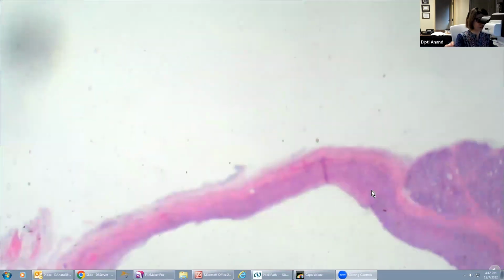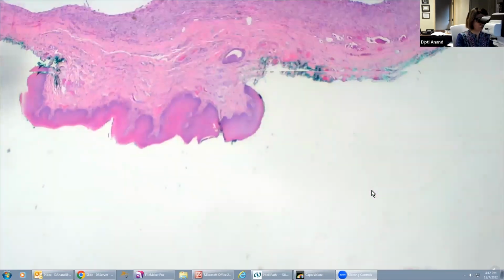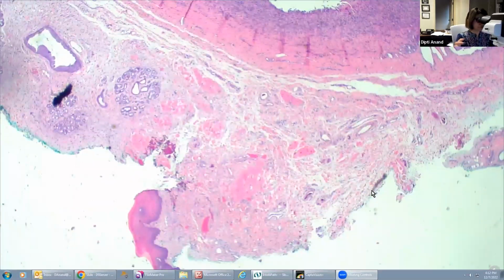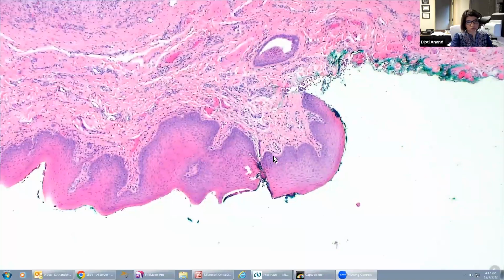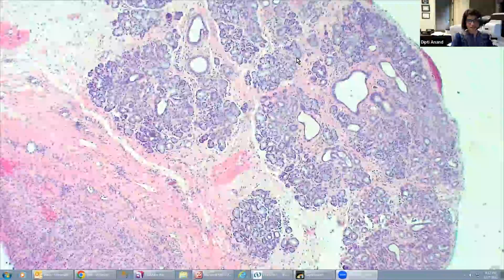The next one is going to be your mucocele. So mucocele, which presents most often on the lower lip, occurs because of obstruction of the draining mucin from the salivary gland duct, which causes the mucin to leak out, producing an inflammatory response around it. So first of all, with the mucocele, you can see different kinds. The most obvious one is when you see the mucosal skin. So you recognize it to be the mucosa. There's no granular cell layer. You see the surrounding salivary gland tissue.